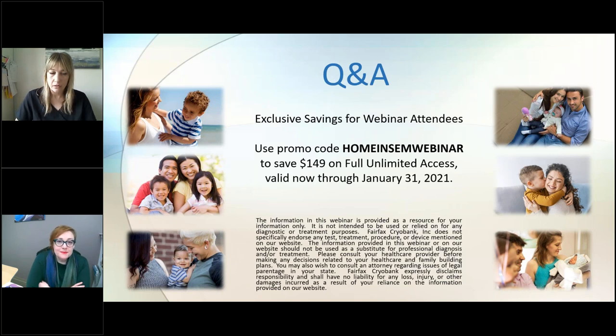And another two-parter for you, Kate. Does it have to be warm? And isn't there more of a chance during a woman's climax? Yes. Does the sperm have to be warm? No. The sperm needs to be room temperature, which is what will happen when you defrost it for 15 to 20 minutes. You don't want the sperm to be frozen necessarily, so that's why we ask you to invert it. You'll be able to see if it falls as one big clump or if it is a thick liquid. So no, you don't need to warm it. You just need it to be room temp.